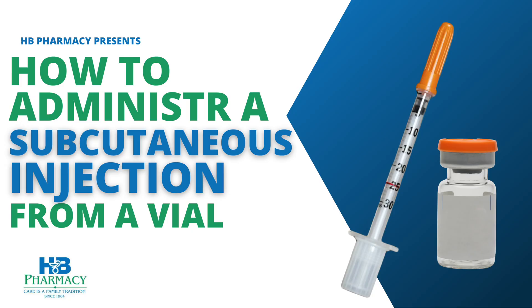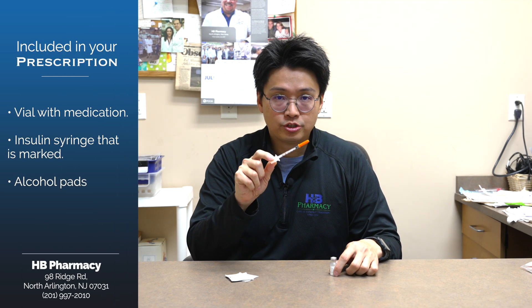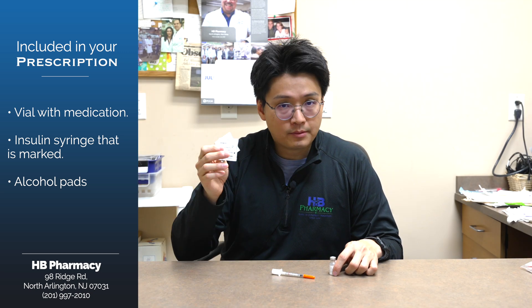Hello, at HB Pharmacy, we provide our patients with compounded versions of semaglutide and tirzepatide. Your prescription will contain a vial, an insulin syringe that is clearly marked with a red line so you know where to draw it up to, and some alcohol pads.